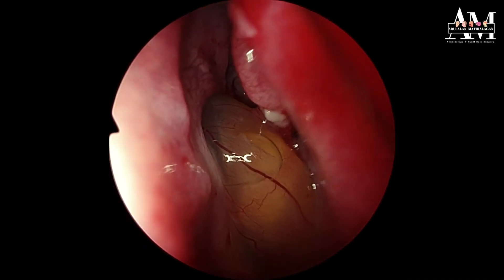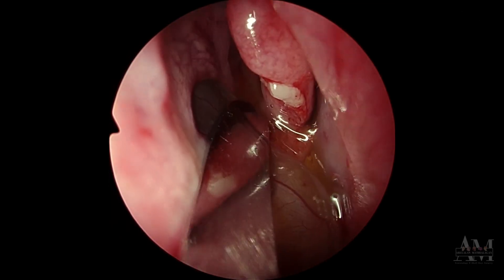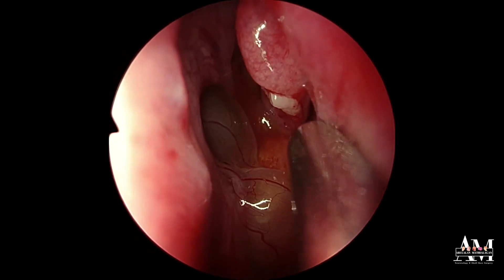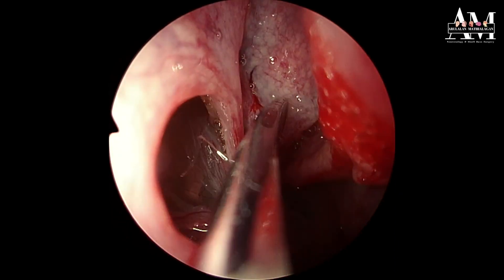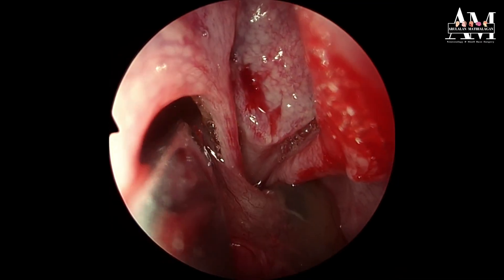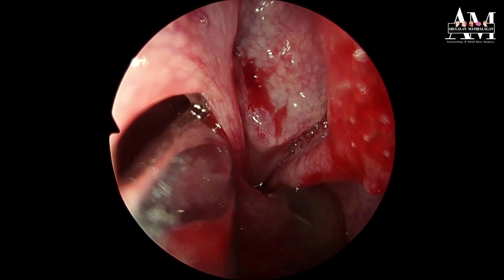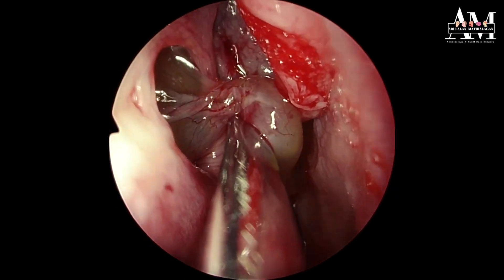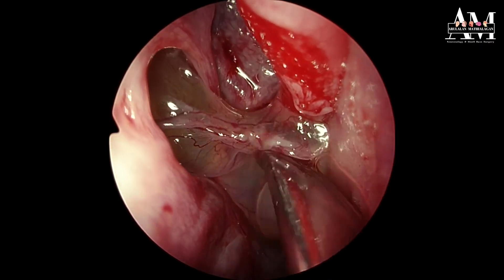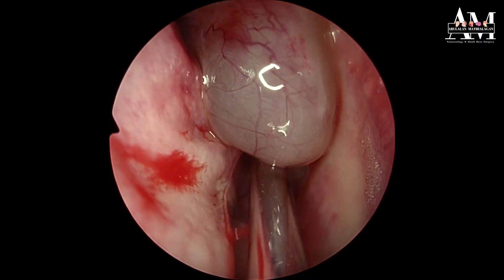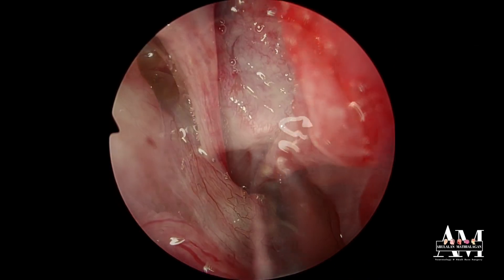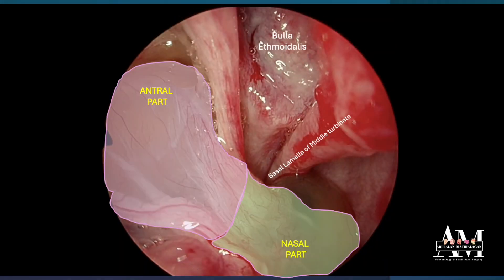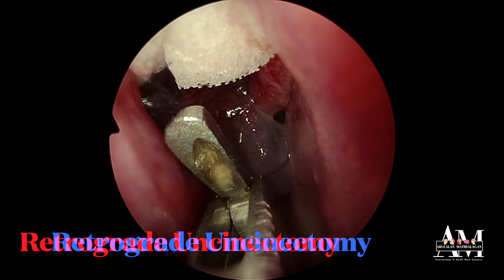We puncture a small hole into the cystic part of the polyp to slightly decompress it so that we can visualize the anatomical landmarks. That is the antral part of the polyp arising from the maxillary antrum. This is the part which connects the antral part to the nasal part. At the rear end it goes into the choana. So we have the antral part, the nasal part, and the choanal part going behind into the posterior choana.